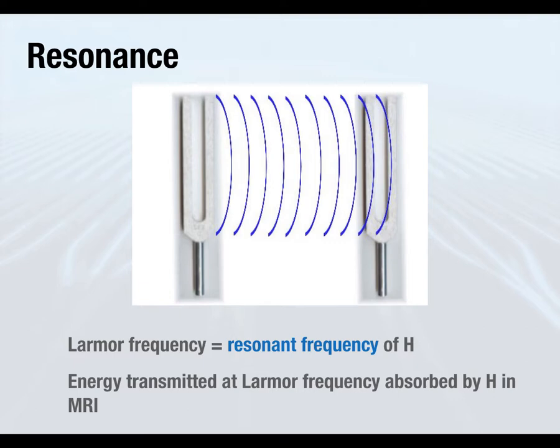Whereas if we send in energy at a different frequency, those protons won't absorb it because it's not at their resonant frequency. So you really have to sync up with the music. Another analogy I like to use is dancing, right? If there's music playing, you dance to the beat. So you're syncing yourself to the beat of the music. And if you're not, then you're going to sort of stand out in a crowd because you're off the beat, kind of thing, right? So we've got these protons, they're precessing.